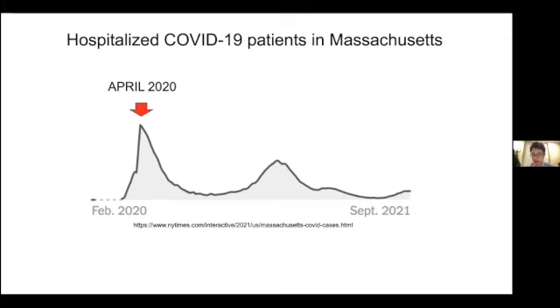And so we were able to get an IRB related to this analysis. At that point in time, how I ended up collecting the data is that through the electronic health record, we had a patient list with all the patients who had tested positive for COVID. And so I'd manually collect that data and the patient information, and then go to our clinical PACS and just manually pull each DICOM one by one.